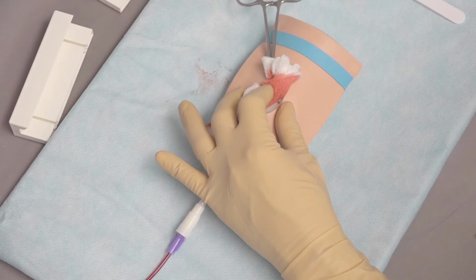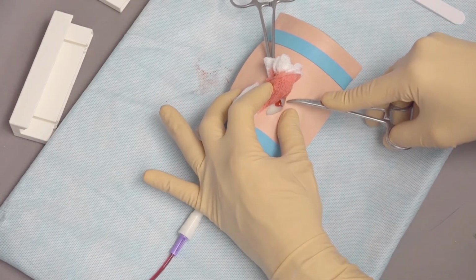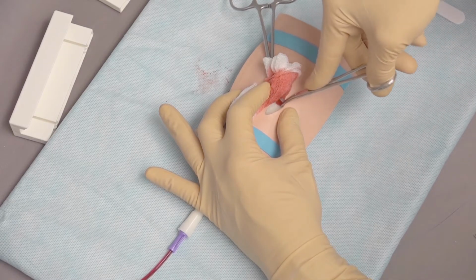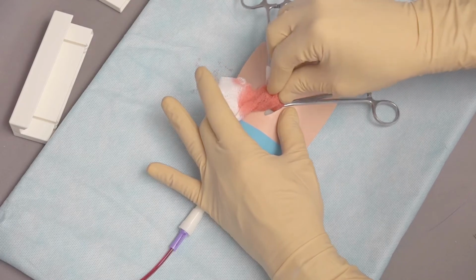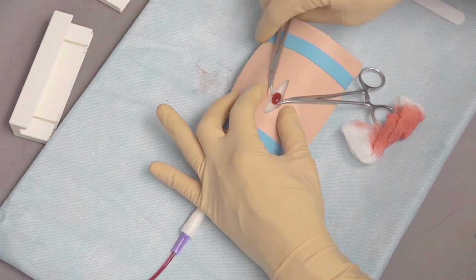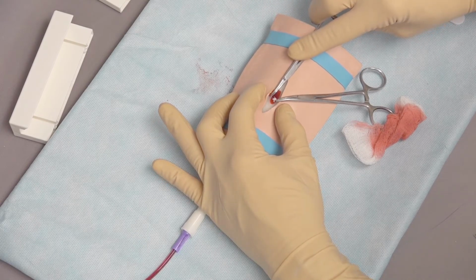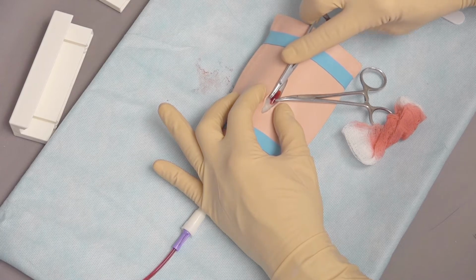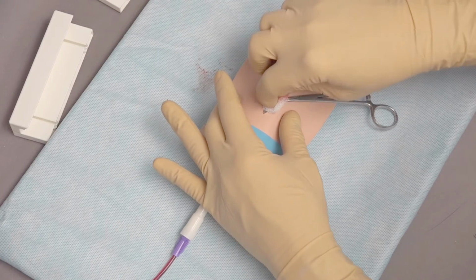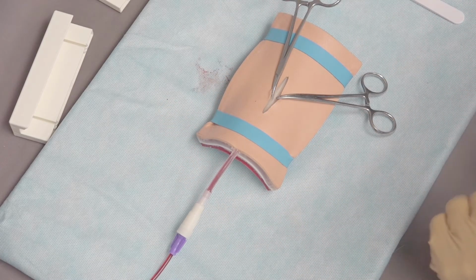Now, realizing that the vessel is going to come from both sides, we're going to work to this side. And you can see the vessel now bleeding there. And so we're going to come in and just get the hemostat on that. Now we're going to come back and look and realize that we missed on the first side, so we didn't quite get the vessel there. That's okay. We can see it nicely there. Edge of the vessel. Now if we use our gauze, we should be able to see that we've completely isolated the bleeding of the vessels.